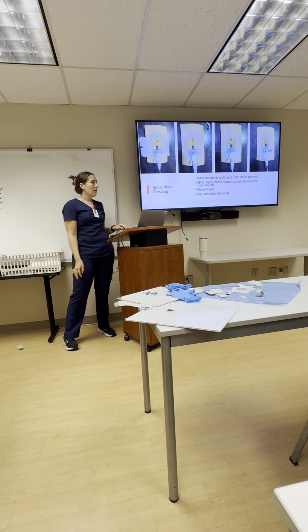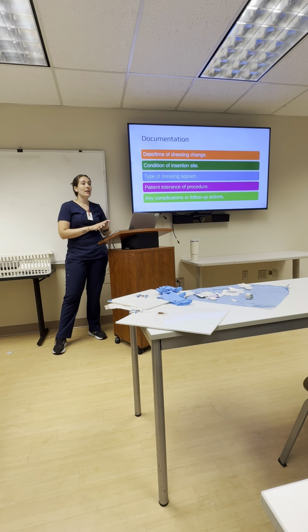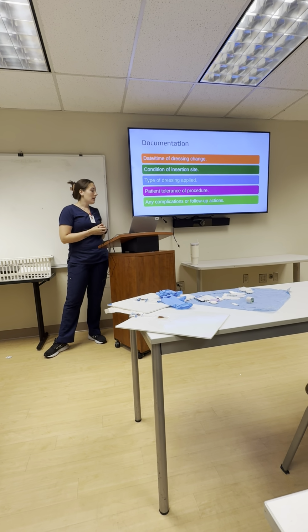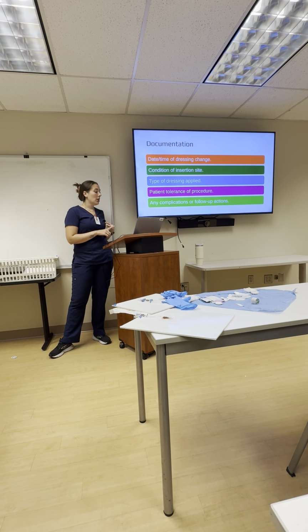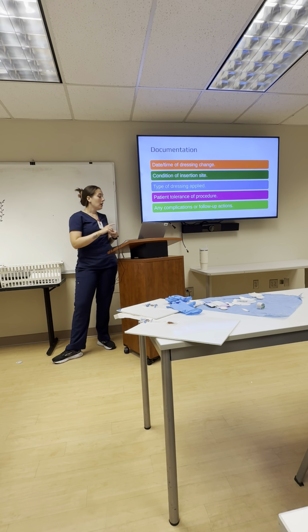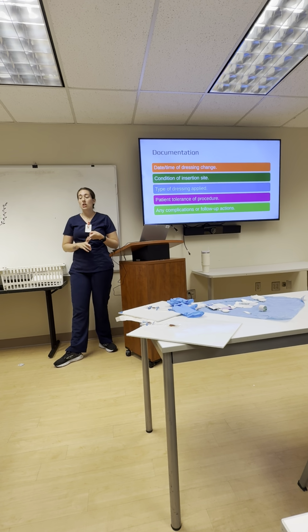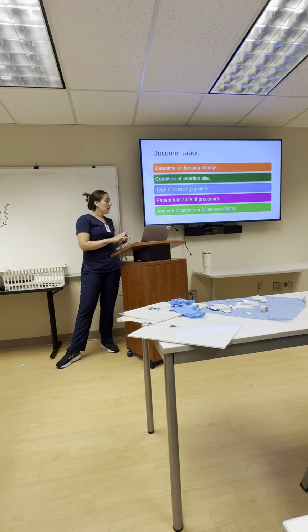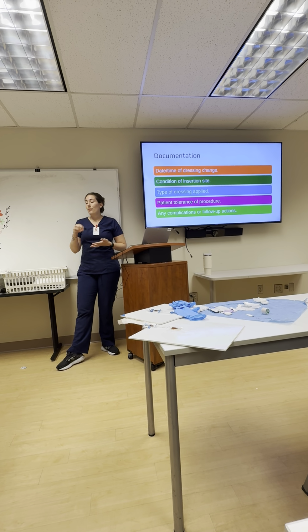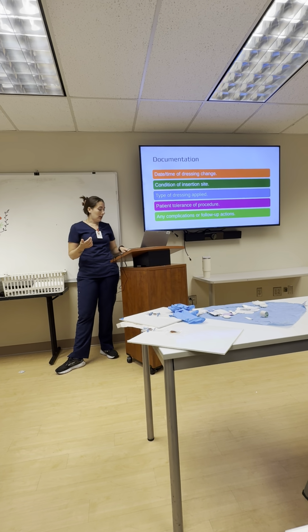Okay. And once we're done with our dressing, we want to document. If we're not documenting in Epic, then it technically did not happen legally. So you want to document the date and time of the dressing change, the condition of the insertion site, what was our assessment earlier when we took the dressing down, what type of dressing applied, was it CHG, was it gauze? If it was a gauze dressing, we need to change it within 48 hours. The patient's pain tolerance, the procedure, was the site tender, were they in pain during any of the dressing, and then any complications, you want to follow up with your provider.